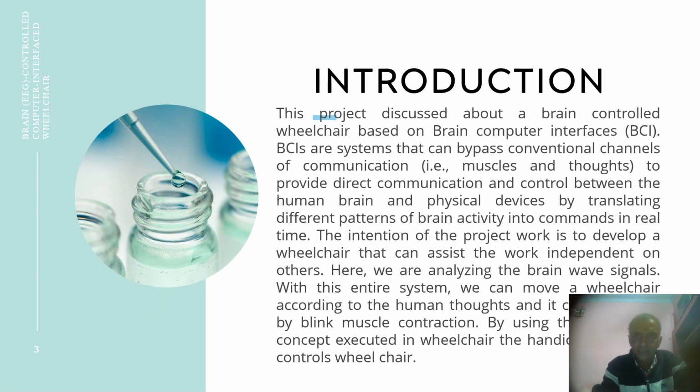This project discusses a brain-controlled wheelchair based on brain-computer interface. BCIs are systems that can bypass conventional channels of communication, for example muscles and thoughts, to provide direct communication and control between the human brain and physical devices by translating different patterns of brain activity into commands in real time.